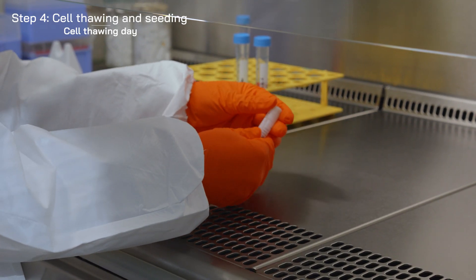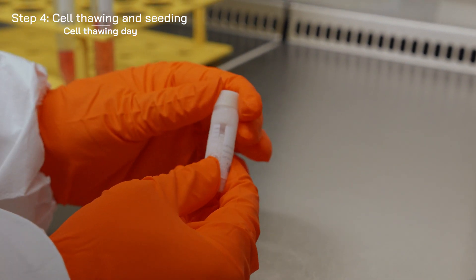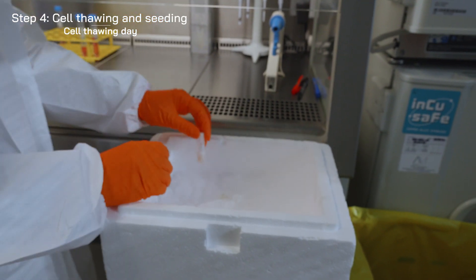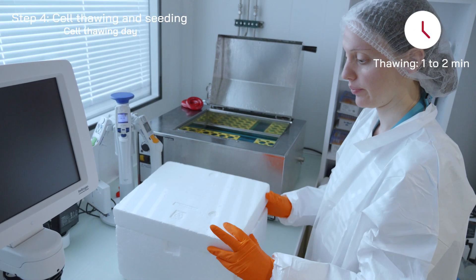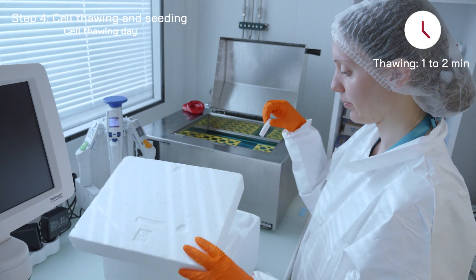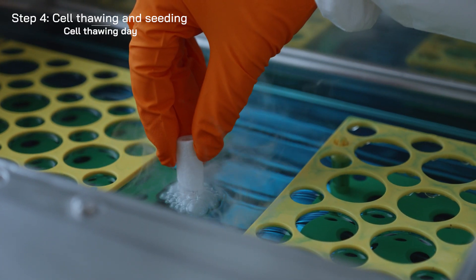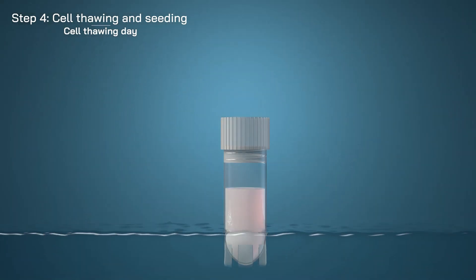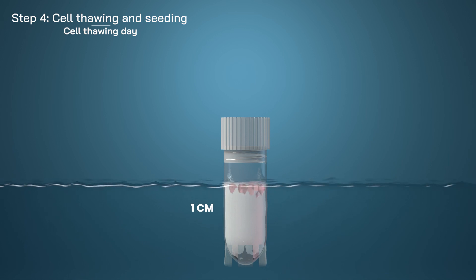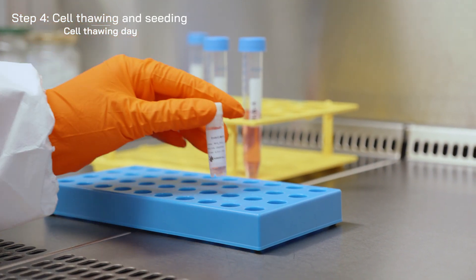Depressurize the vial under laminar flow. Immediately thaw the cryovial for 1 to 2 minutes in a 37 degrees Celsius water bath. It is crucial that thawing remains incomplete when adding medium to the cells. When the ice cube is approximately 1 cm high, remove the cryovial from the water bath.